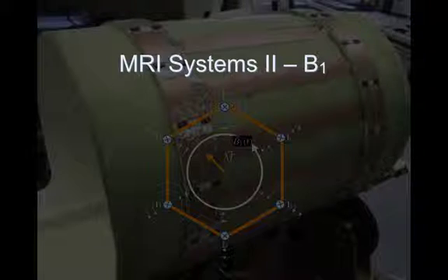Okay, so welcome back, week 2, right? This is sort of the continuation of our hardware lectures. What we'll focus on today is the B1 system. The primary responsibility of the B1 system is to do what? Anyone know? I have one word that I usually use. Thank you. It's the exciter, right?